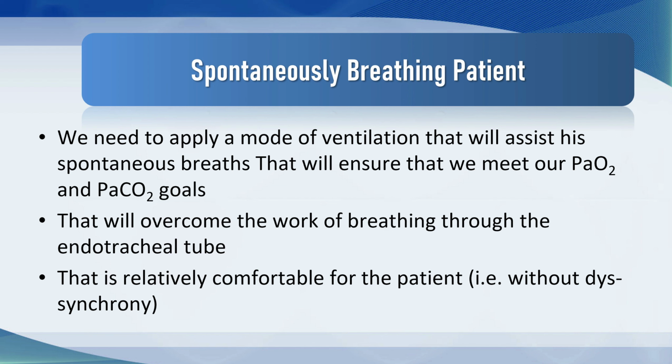We need a mode that will overcome the work of breathing through the endotracheal tube, and one that is relatively comfortable for the patient. And what I mean by that is that there isn't patient-ventilator dysynchrony at the beginning of the breath, in the middle of the breath, and at the end of the breath.